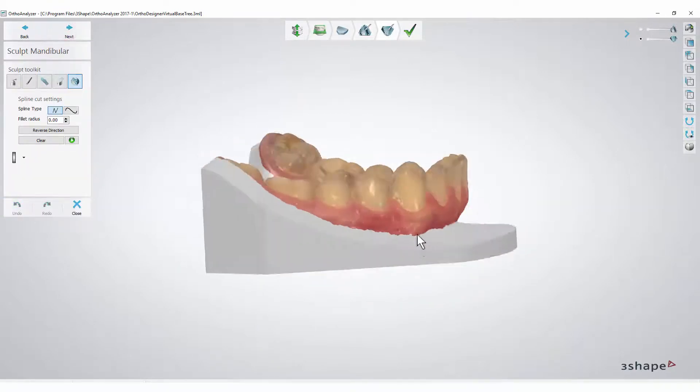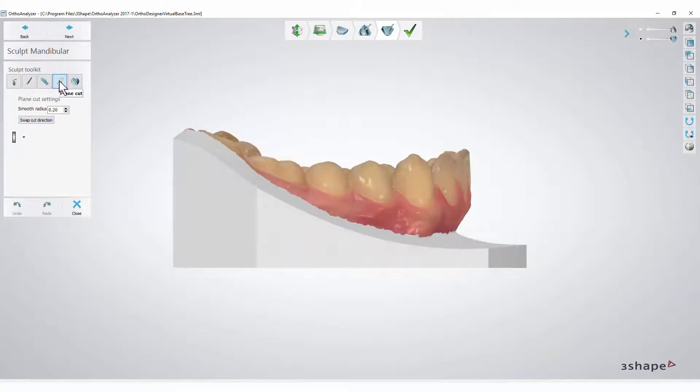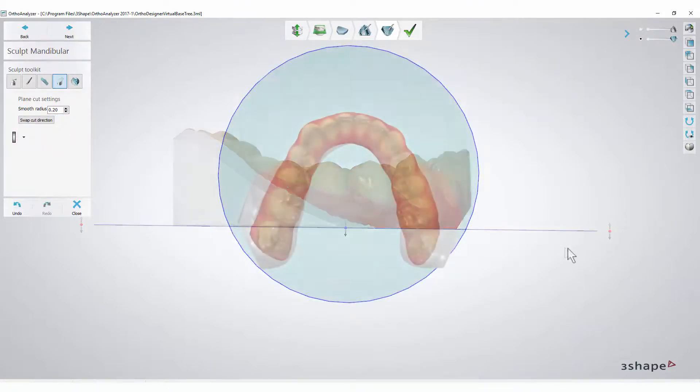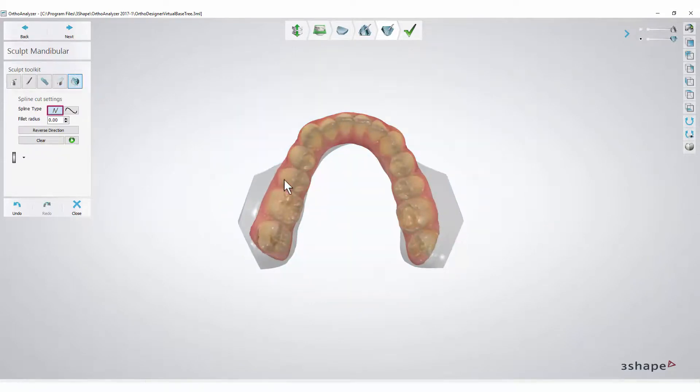You can follow the same process for the lower jaw. Select a side view and press the Plane Cut button. Here you may use the second method for creating a line. The straight edge is selected by default — just set the points on the model and they will automatically create a line.